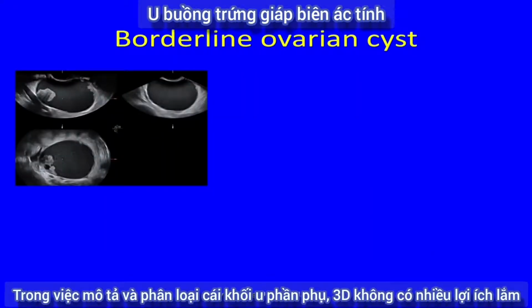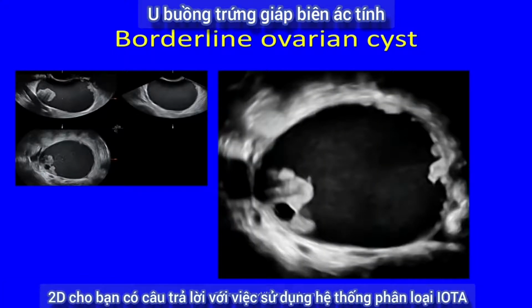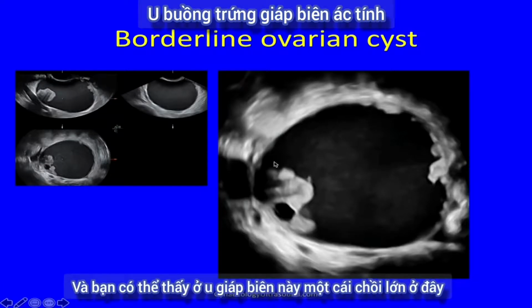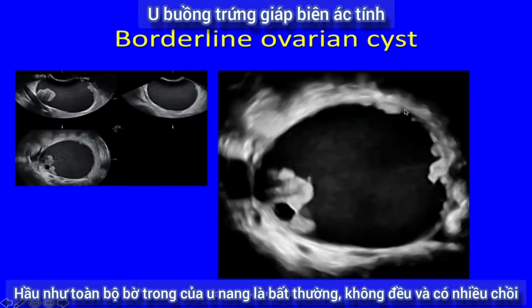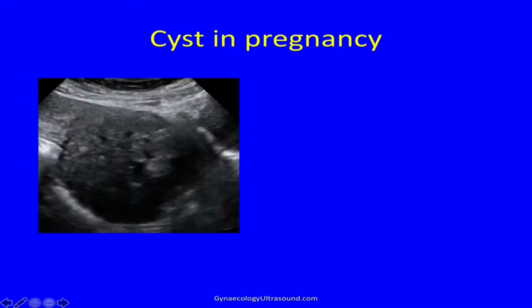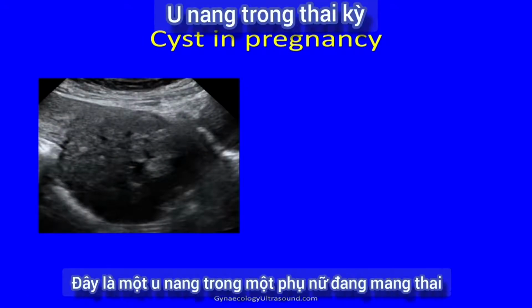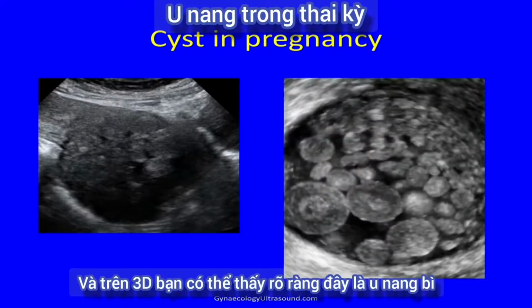In the characterization of adnexal masses, 3D is not so useful. 2D gives you the answer using the IOTA classification system. But I always put 3D on just to see what else I can see. And you can see that in this borderline cyst, you've got a large papillation here, but that almost all of the internal cyst wall is abnormal with irregularities and papillations. But in this case, it was really useful to have 3D. This was a cyst in a woman in pregnancy. And on 3D, you can clearly see that this is a dermoid.